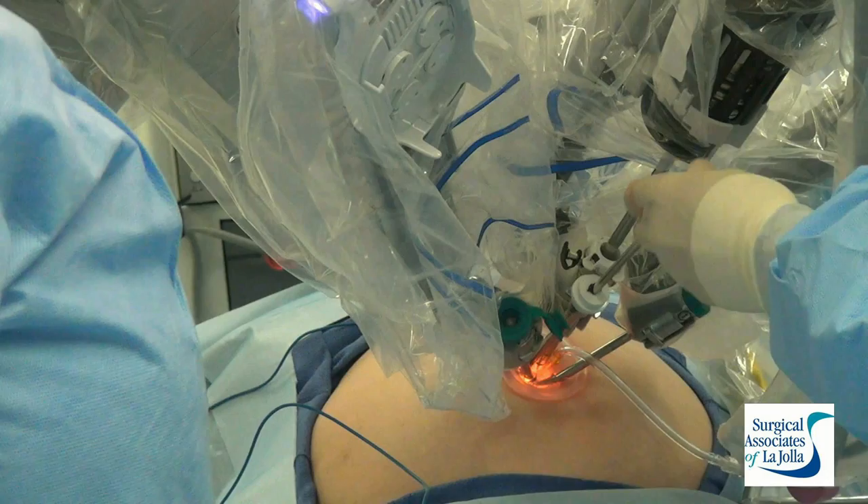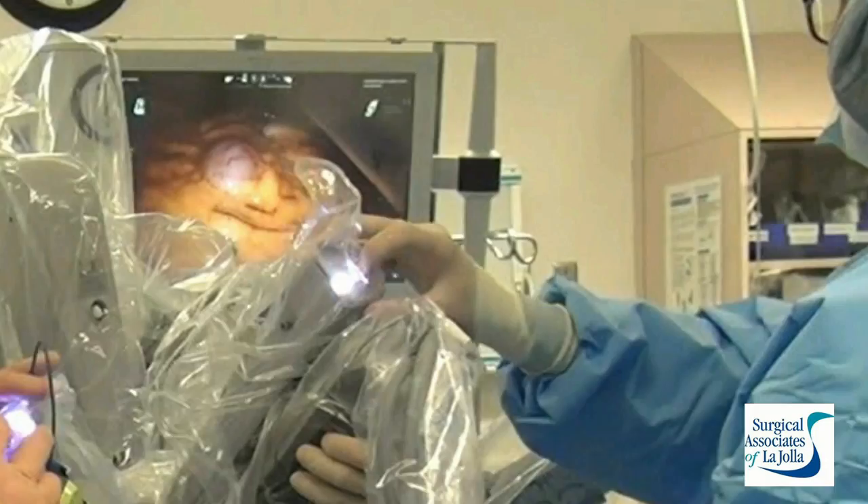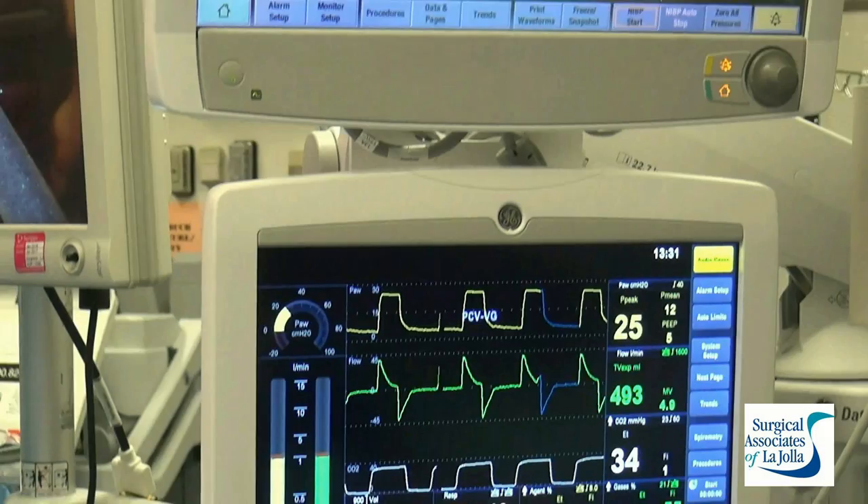The assistant port is inserted here. This is the only free port where the assistant controls the gallbladder and the level of traction on it. Once we put the camera back in, we look directly at each cannula and insert instruments only under direct vision, advancing them very carefully so that nothing is inadvertently damaged.